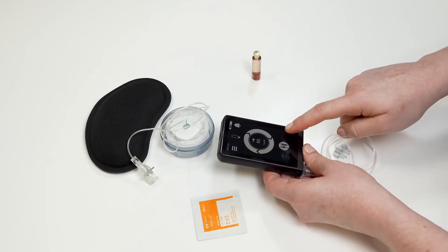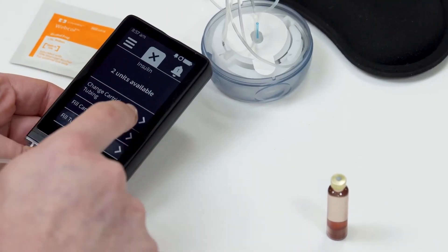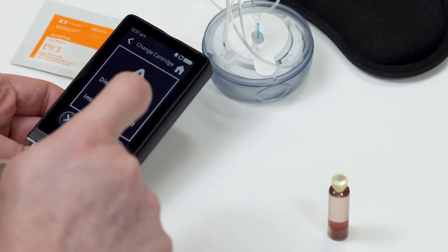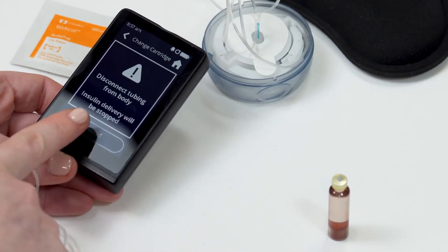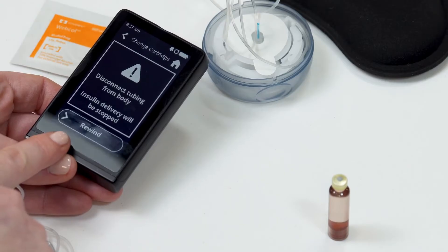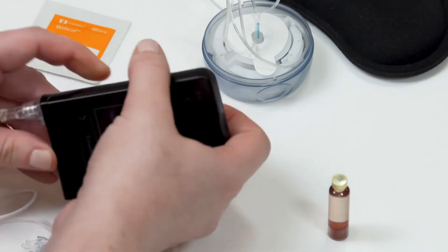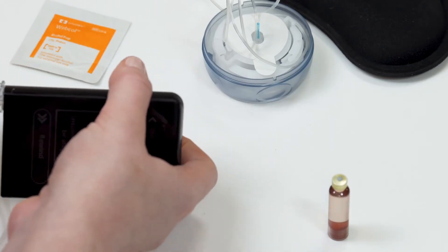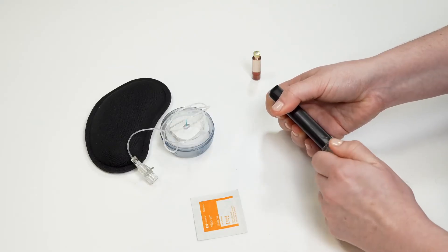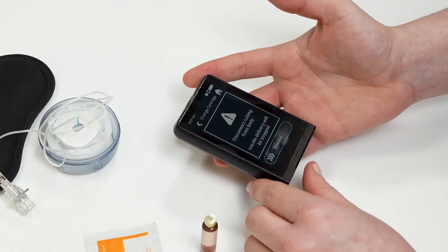Make sure you are disconnected from your islet. You should always be disconnected from your islet when changing your cartridge and infusion set. Remove your old cartridge and tubing from the islet. Do not insert your cartridge until your islet has completed the rewind process, as this could damage your islet and insulin cartridge, as well as accidentally push insulin through the tubing.